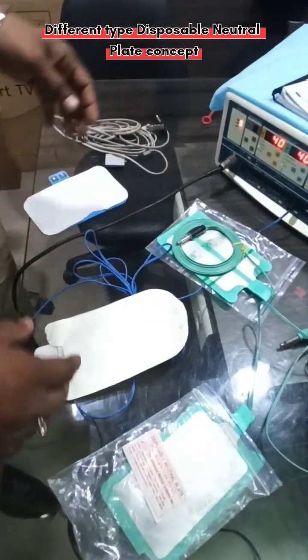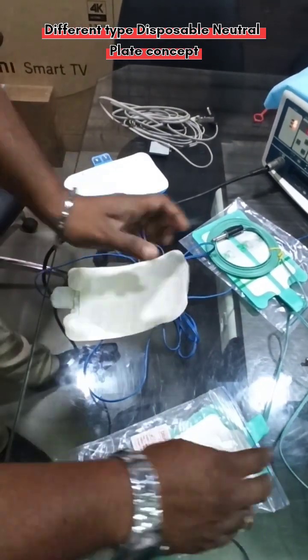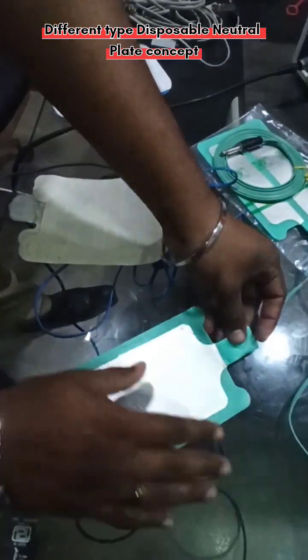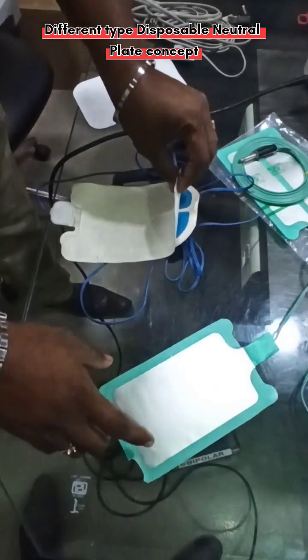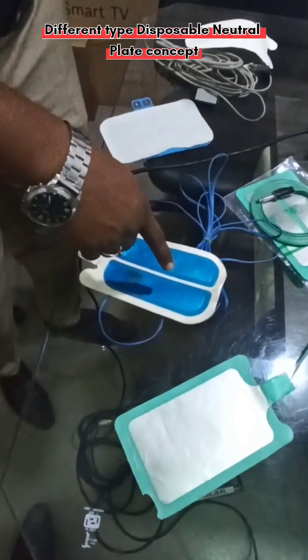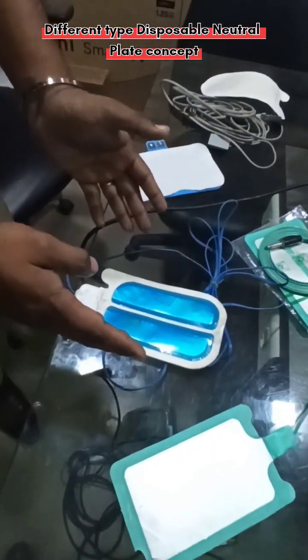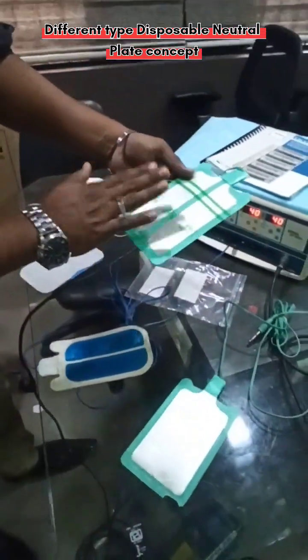There are two major types of earth plates. When you open this jelly area, you can see this is a single-section earth plate — we call it a single-section earth plate. And this is the split type — you can see in the middle area there is a split, so two sections are there. It is called a split-type earth plate.